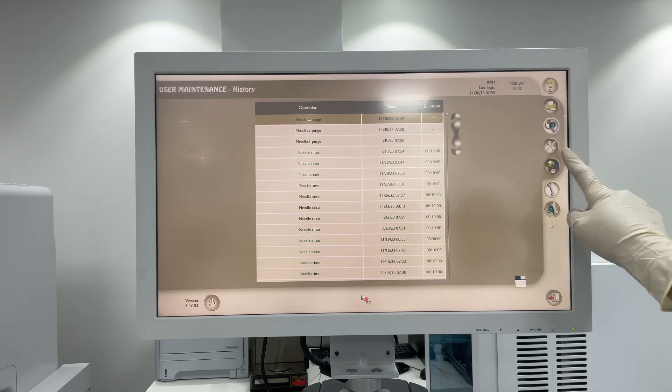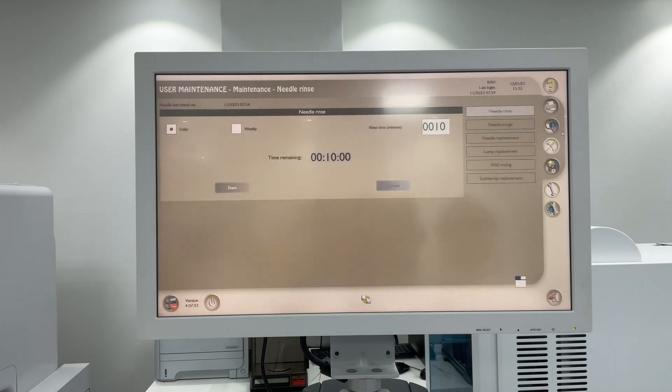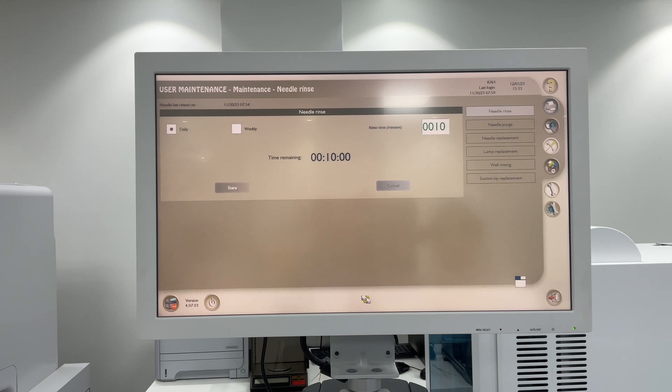Then click here on Tools, so you will have here User Maintenance. Then you can do Needle Rinse and Needle Purge. We will go to Needle Rinse and start.